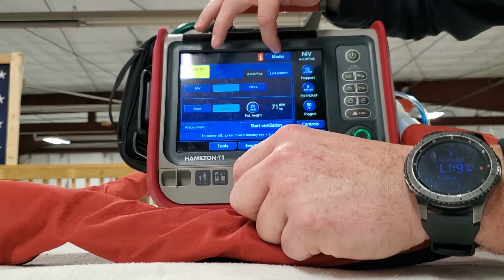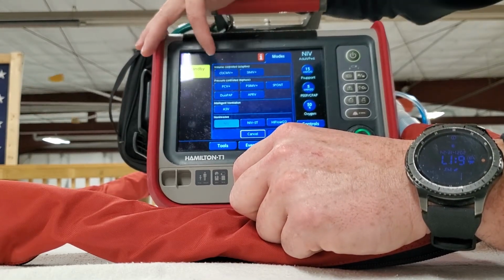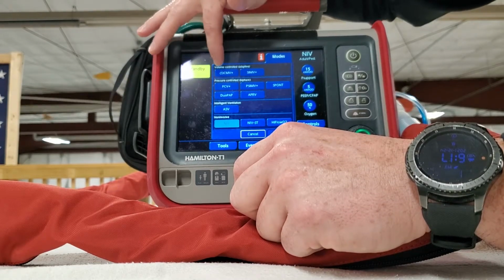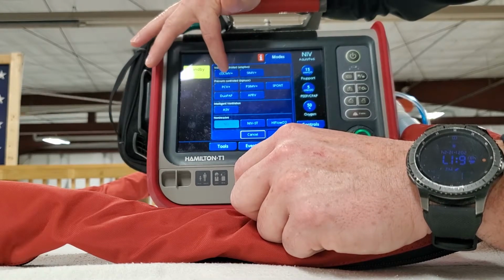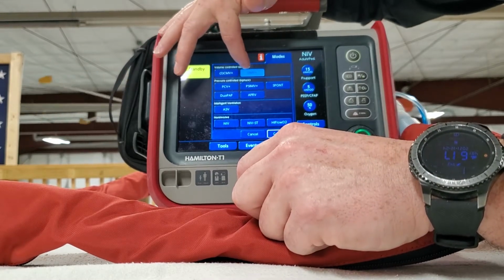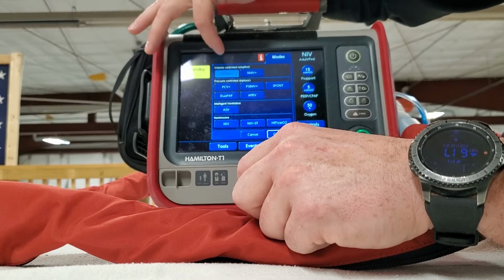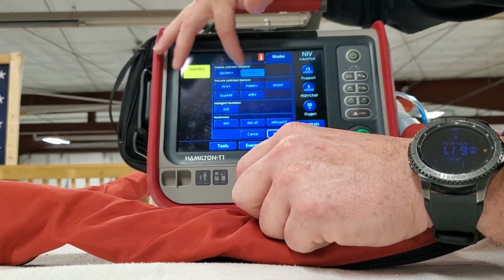If we go into the modes tabs, it gives you everything that you wanted. So these are volume controlled and adaptive. If you weren't doing a ventilation strategy where you're wanting to use volume as your measurements, you'd have CMV plus, SIMV plus. I'm going to explain the difference in another video, but there's no assist control, which is what we use on the Zoll. So this is going to be the other thing you'll use.